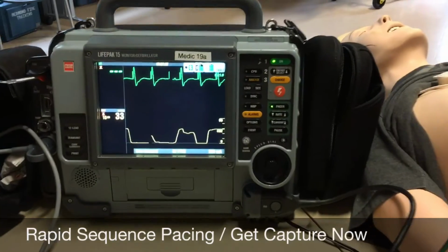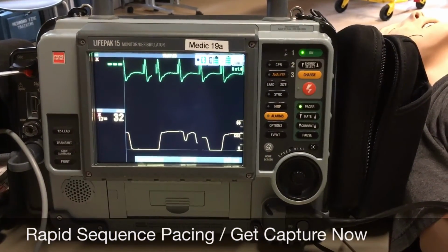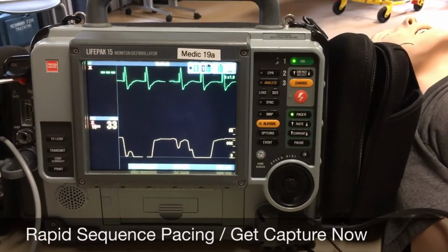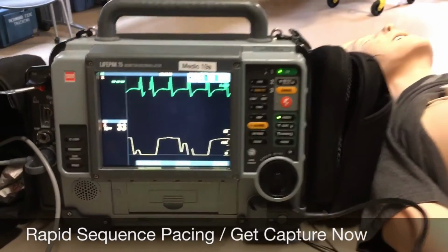You can see now that every single beat is a wide complex beat after a pacer spike, and the underlying rhythm is no longer available to see. That is true capture electrically. Then we want to go to the patient and verify that mechanically.